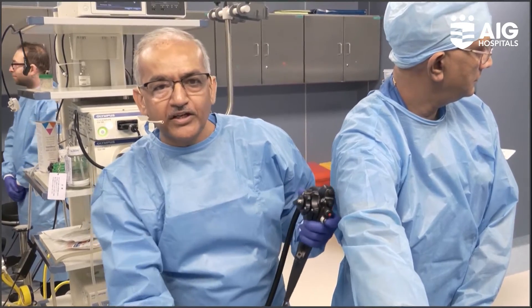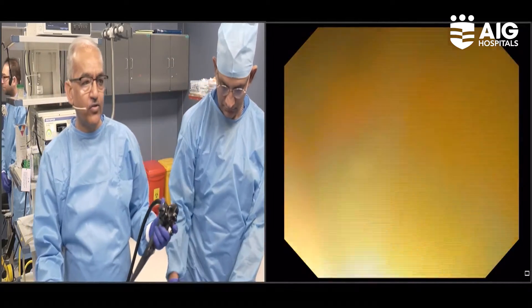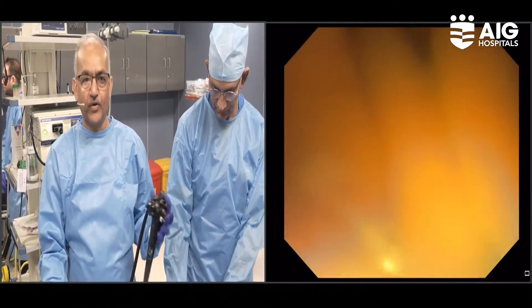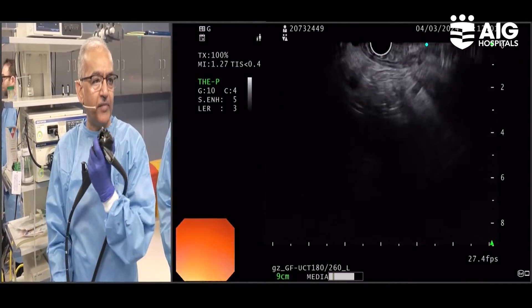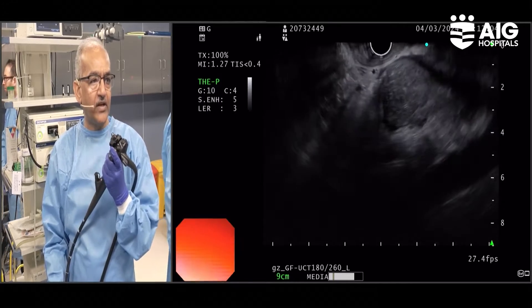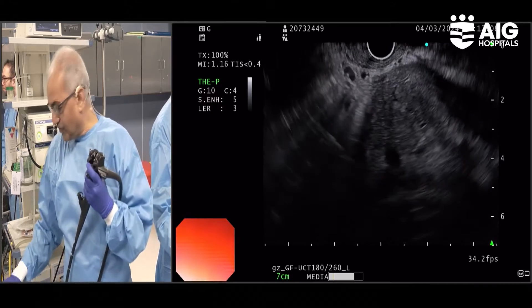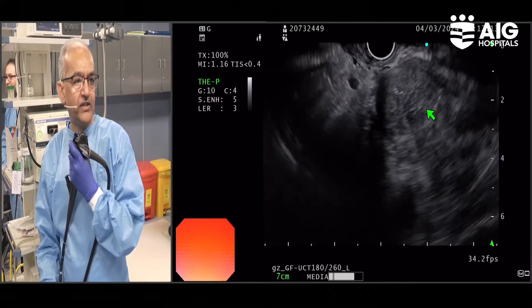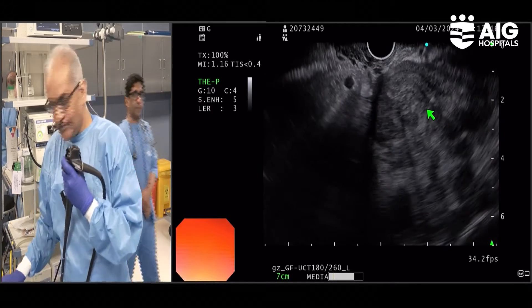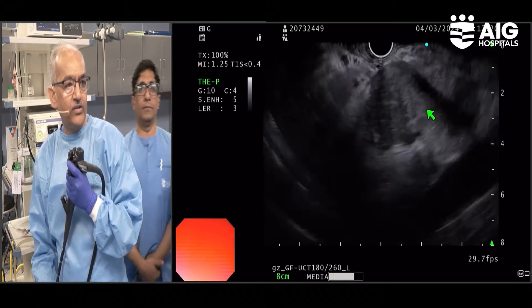I am inserting the linear EUS scope inside. Let me switch to the endosonography image. I am seeing the posterior part of the patient and we can see a mass — a large mass in the posterior part of the pancreas. I will use an arrow to point it out. This is the mass going deeper down, and it looks neoplastic.